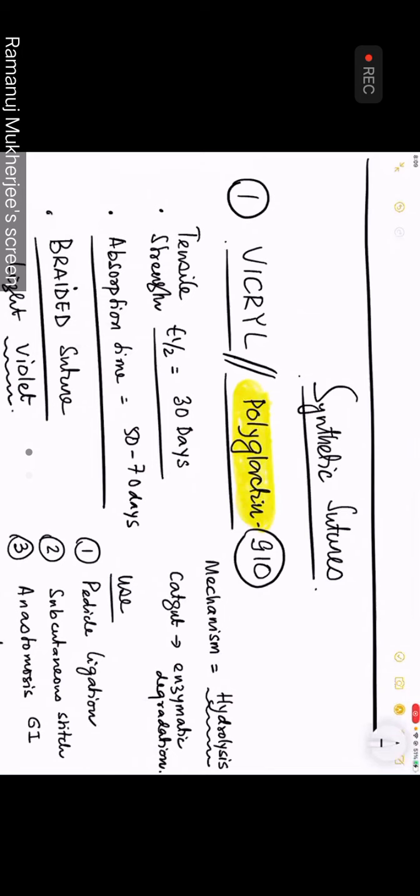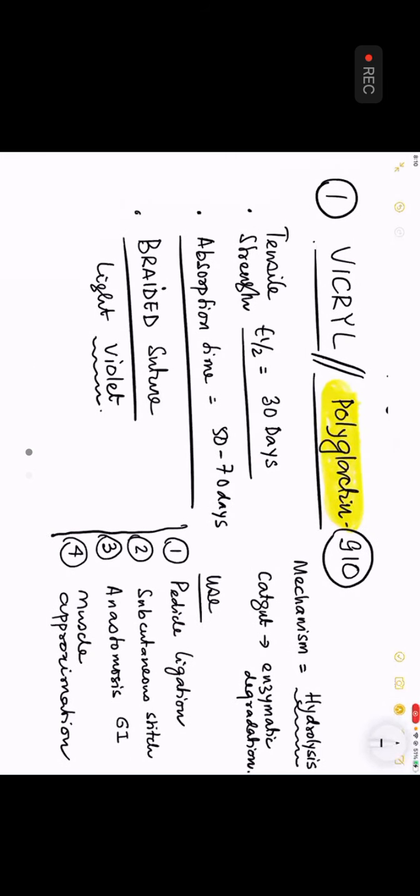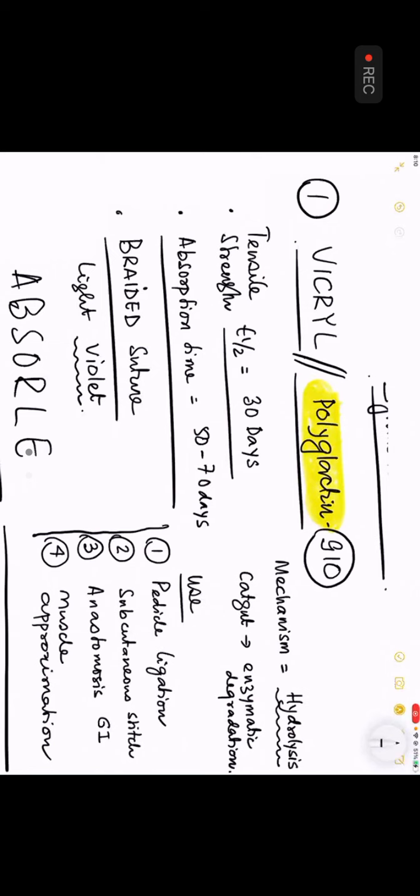So this is a suture that we as surgeons use in the majority of the cases. We know that. So this is called the Vicryl suture. The Vicryl suture, remember, is an absorbable suture. Is it synthetic? Yes, it is synthetic. It is absorbable. I'm bad with spellings. So this is absorbable suture. Use is important for exams. You are required to know what is a Vicryl suture.